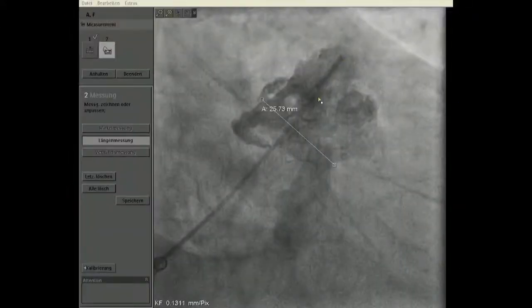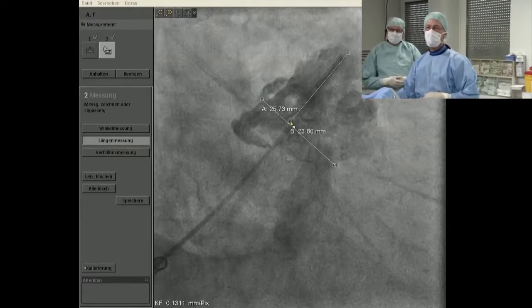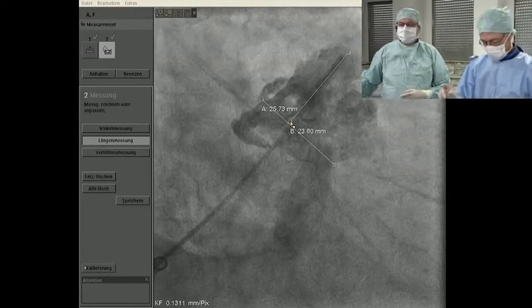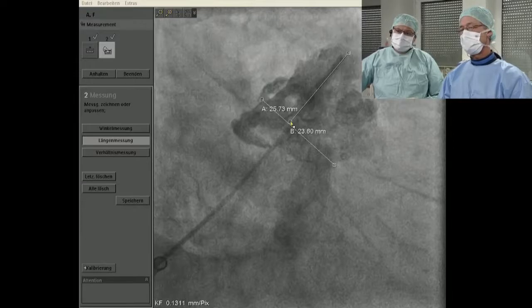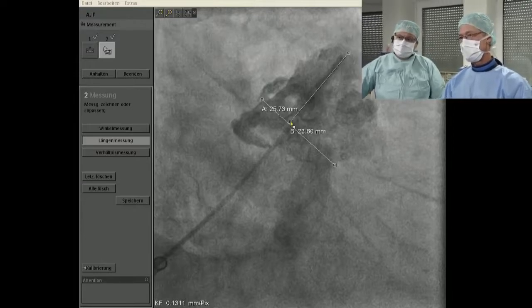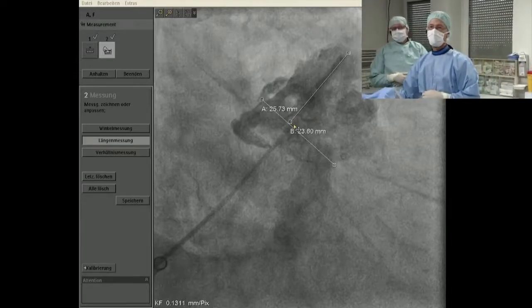Okay. So, Maurice, when you look at the image here of the fluoro, you can see that the landing zone has 26. Yes. And the length of the longest lobe is 24. But this is not the functional landing zone, which is only 6 millimeters. So you will have a shoulder if you're doing the Watchman, but it is an understood shoulder that you have to know from the beginning.